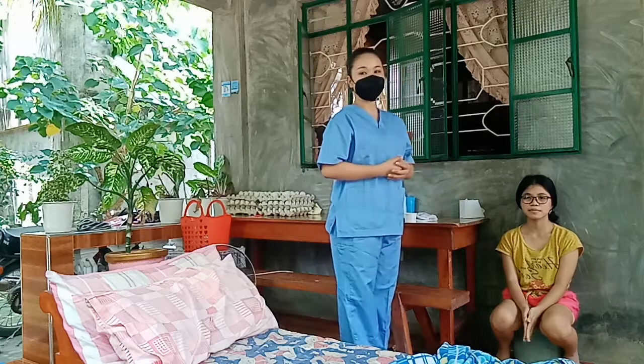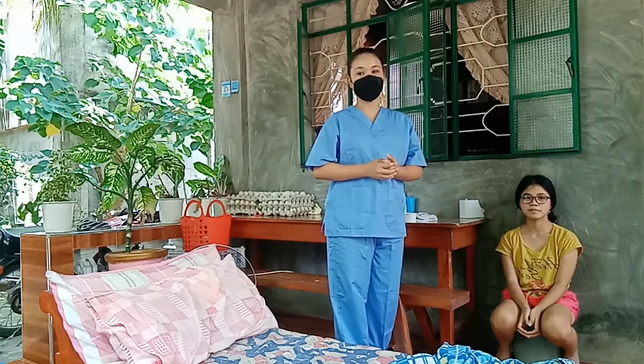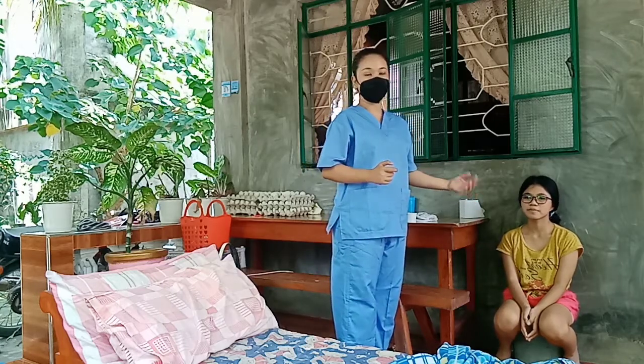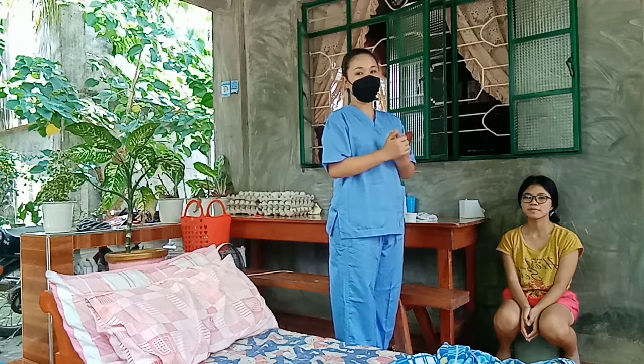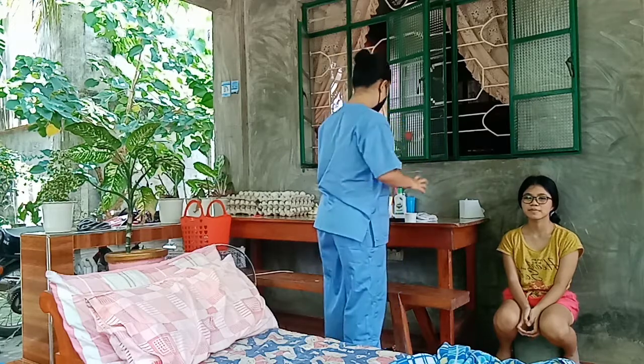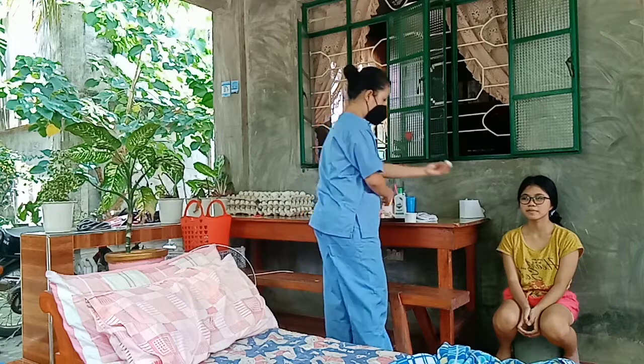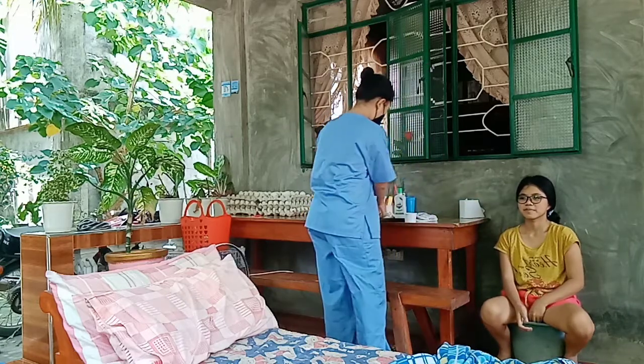The next is rinse area and dry it with cotton ball if agency procedure indicates. So let's assume that the area is already rinsed. Then let's dry it with the cotton ball. Dry the area, ma'am. Cotton ball.